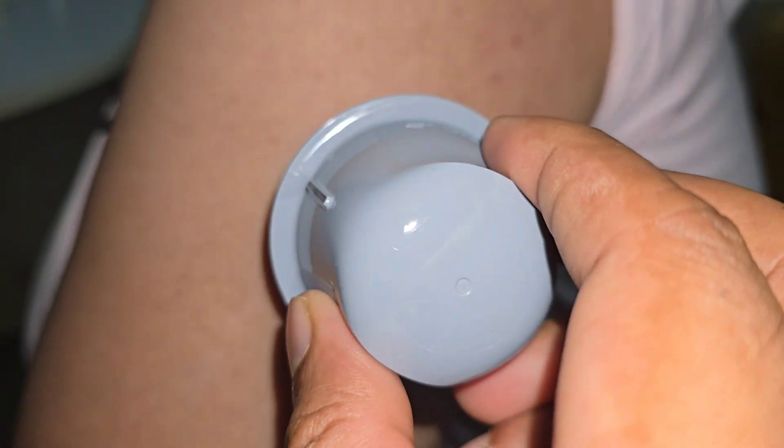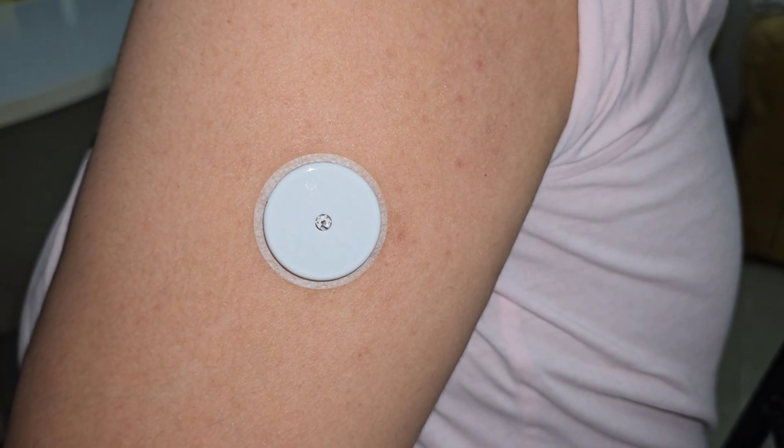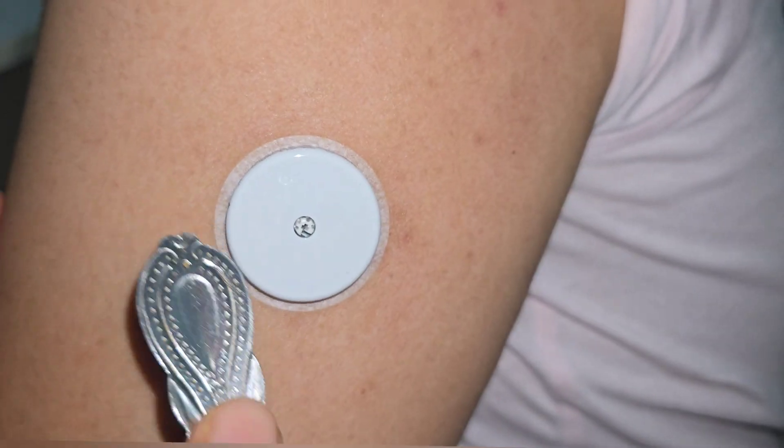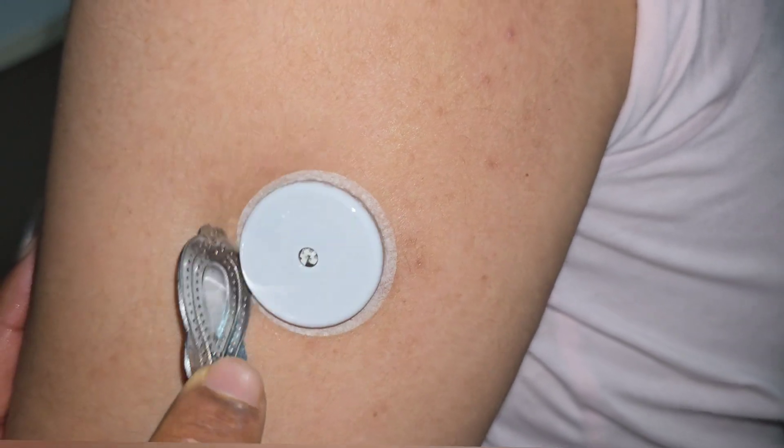Take the sensor applicator and push it firmly on the cleaned area. Then take your spoon with the sharp end and push down the edges of the sensor. Press down all the edges carefully.